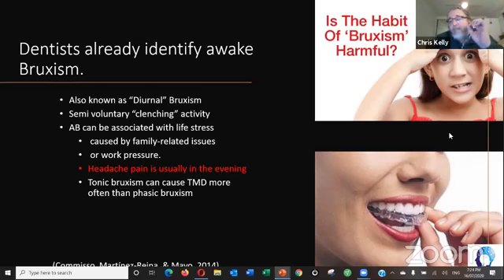But in the end, the characteristic of electromyography is found in repetitive and recurrent episodes of what we call RMMA, which is, now I'm going to stumble on this, rhythmic masticatory muscle activity.